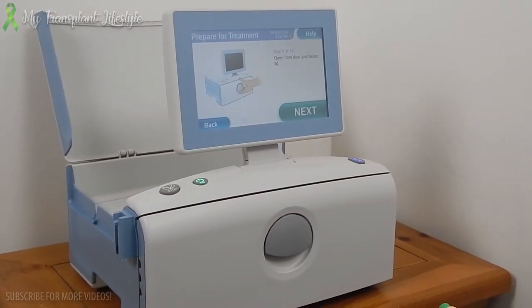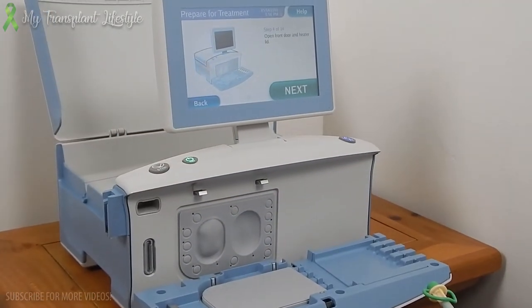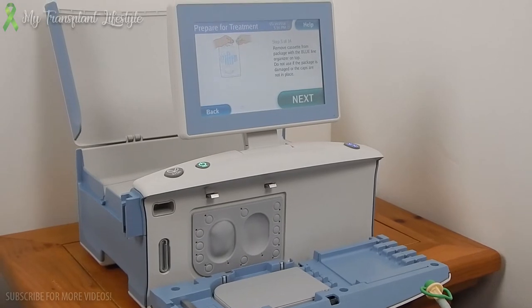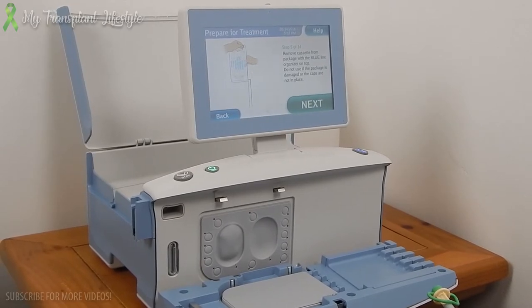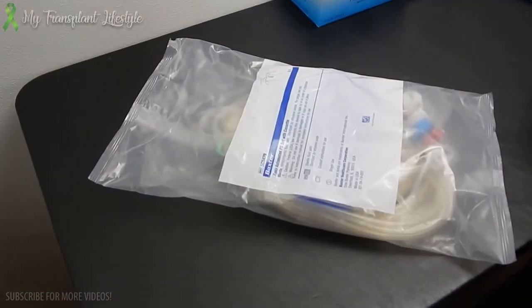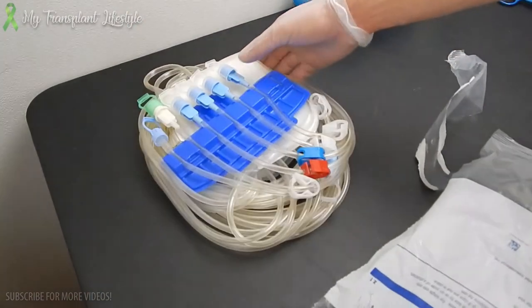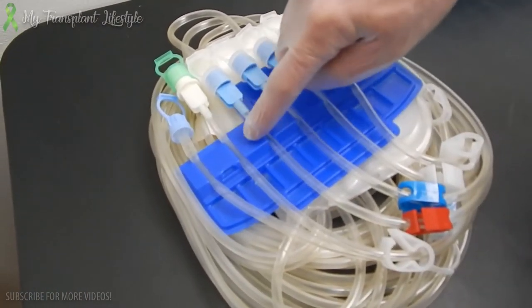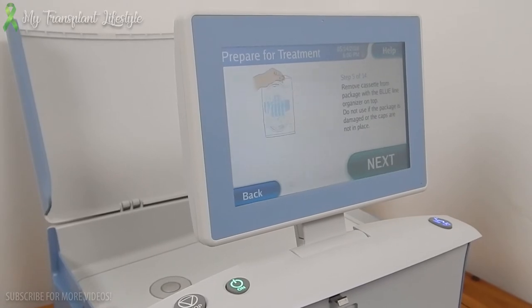Open front door and heater lid. Remove the disposable set from its package with the blue line organizer on top. Do not use if the package is damaged or if the caps are not in place. Now it's time to open the cassette. First, we have your drain line, the patient line, and the four solution lines. Once you have your cassette ready, press next.